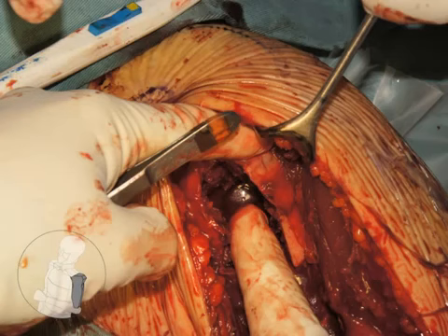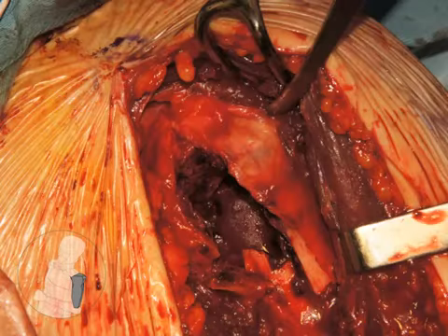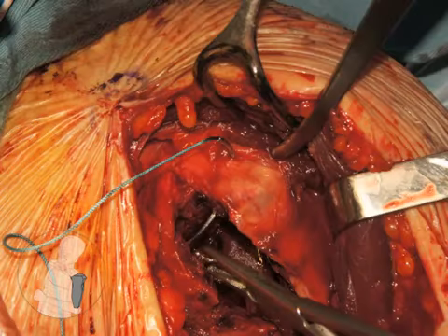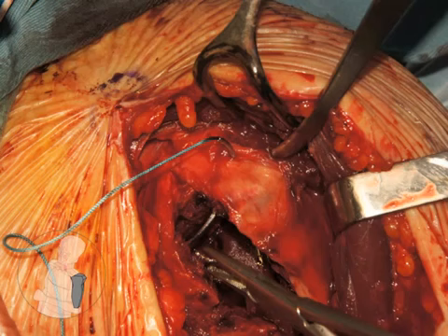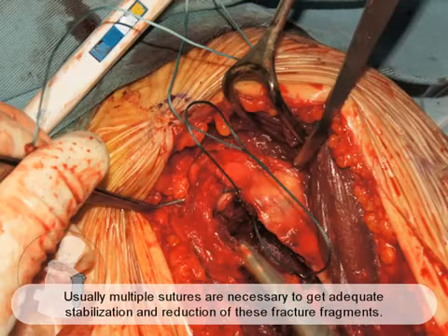Looking at pictures during surgery, we see the tuberosities are being brought around, and we see that they're matching up nicely to the level of the articular segment. We're now ready to start reducing our tuberosities. These will be reduced and stabilized by using large non-absorbable sutures, which are placed through both the greater and lesser tuberosities. Usually multiple sutures are necessary to get adequate stabilization and reduction of these fracture fragments.